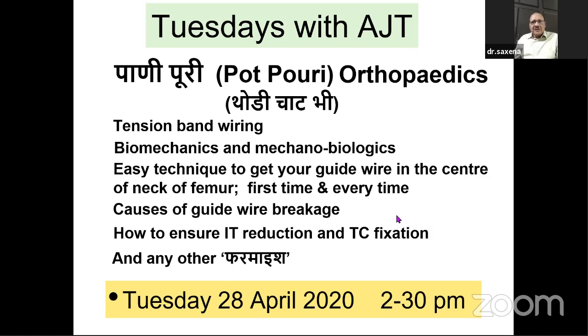Yeah, in the second part of the talk, he mainly mentioned the infection at the pin site and also the dynamization part. As far as the infection is concerned, my way of preventing it was like this. I would suggest that when you introduce a pin, the skin incision should be quite liberal. If you put a pin in a very tight manner in the skin, then it definitely will get enlarged and the chances of infection are there. So a liberal incision while putting a pin or a wire, as I do in Ilizarov.